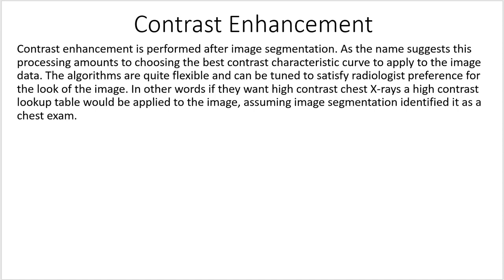Contrast enhancement is performed after image segmentation. As the name suggests, this processing amounts to choosing the best contrast characteristic curve to apply to the image data. The algorithms are quite flexible and they can be tuned to satisfy radiologist preference for the look of the image. In other words, if they want high contrast chest x-rays, a high contrast lookup table will be applied to the image, assuming image segmentation identified it as a chest exam.